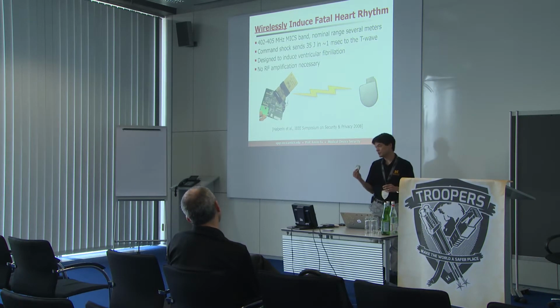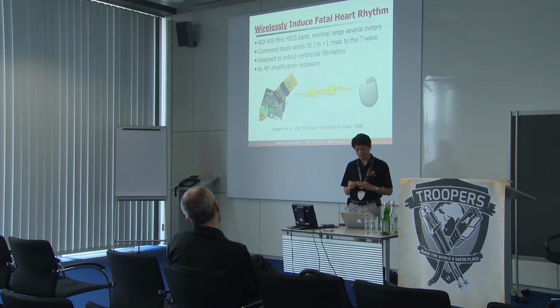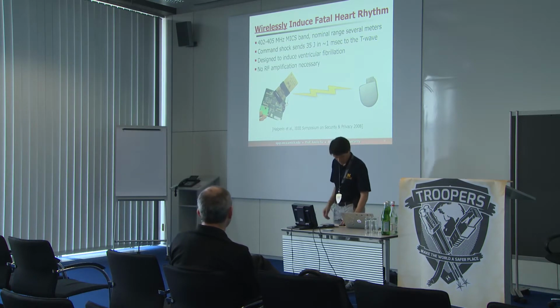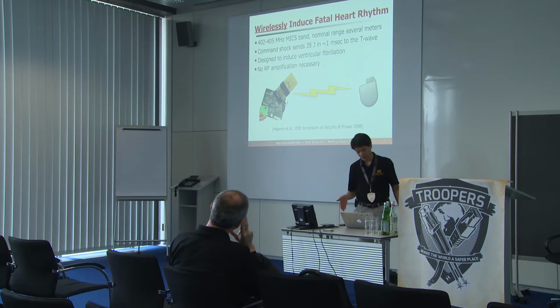So built into every device is a wireless debugging command to induce ventricular fibrillation, which is a deadly heart rhythm. So it's called a command shock. So we recorded this command shock, and then we replayed it. But before we did that, we recorded the command to disable all therapies. And so we disabled all the therapy, basically all the triggering events that would stop the life-saving shock. And then we sent the shock that would induce the ventricular fibrillation. We couldn't find anyone willing to do this for us, so we had to do it in vitro. But it did indeed work, and we measured a large shock coming out of it.